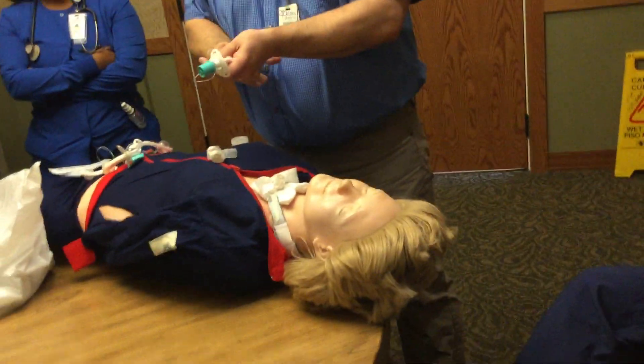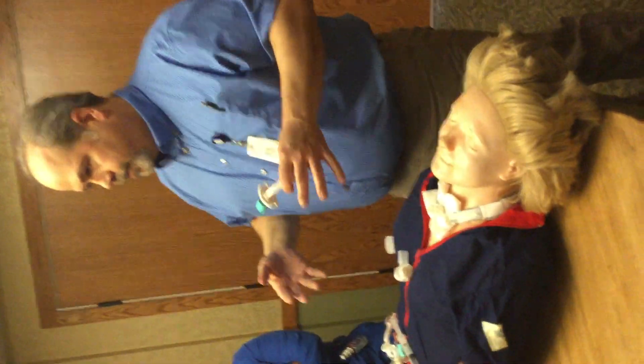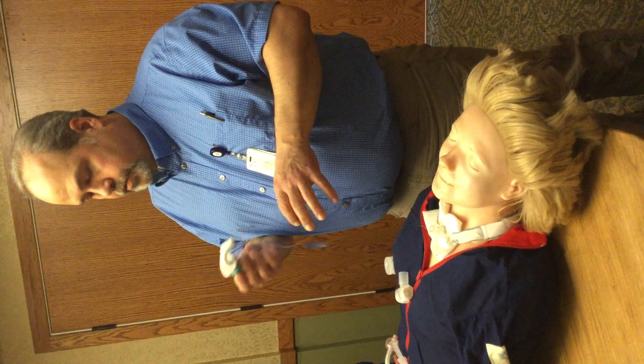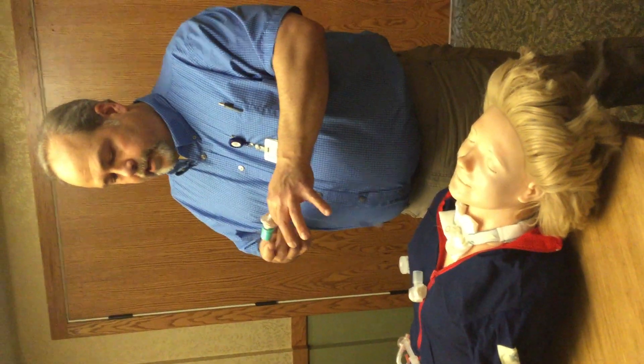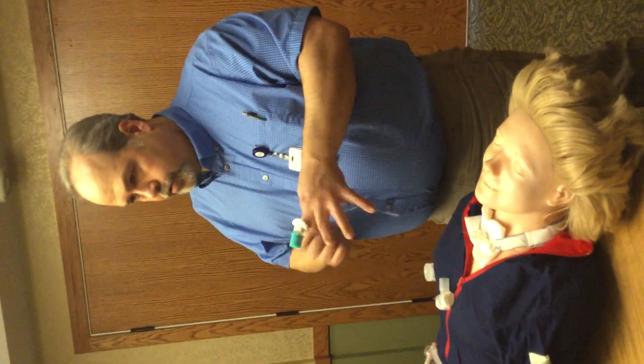This gentleman is deflated all the time, which makes it nice so you don't have to worry about it. He's inflated at night and uninflated during the day with the speaking valve on all the time. With the cuff deflated, he can breathe in through the tube, he can breathe around the tube, and he can exhale around the tube.